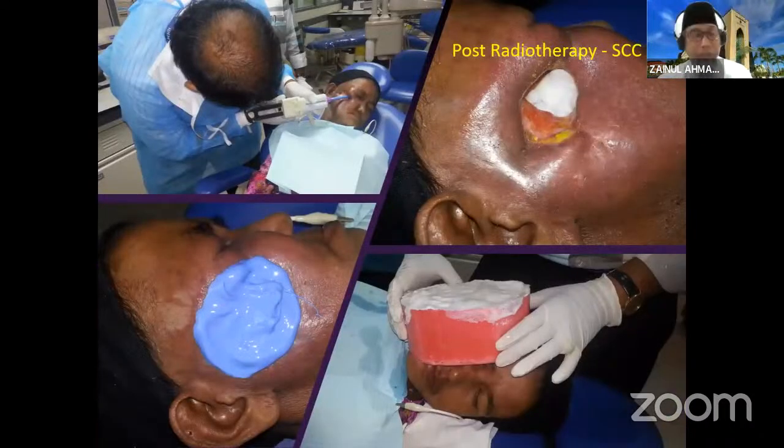This is another case. Before this, there are a few cases that I'm going to finish soon. Just to tell you that this is some of the manual method of doing it, for a patient post radiotherapy secondary to squamous cell carcinoma. We can see the lesion here is a big lesion. We can see the cavity at the right area of the cheek, involving not only the zygoma but going deep into the maxilla. This is one of the previous methods that have been done.